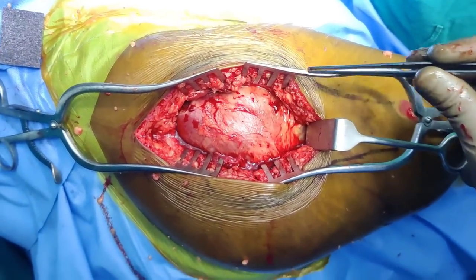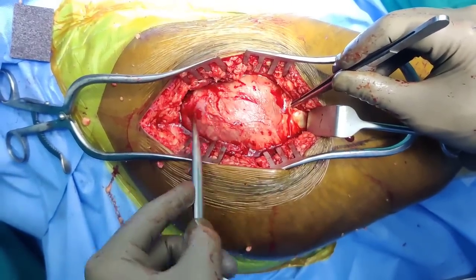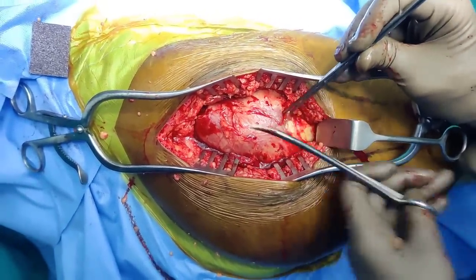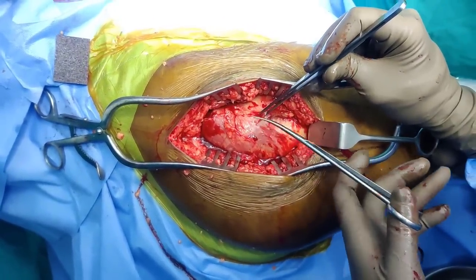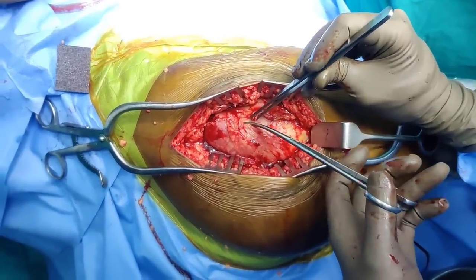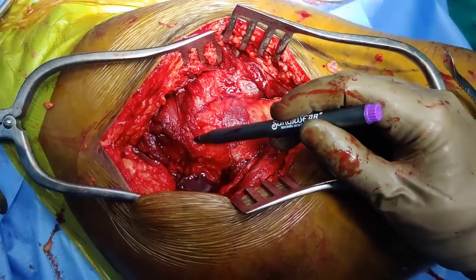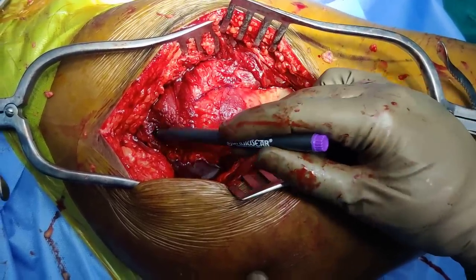We have repositioned our self-retaining retractor in the front and in the back. This is the vastus lateralis, this is all the gluteus medius, and overlying on the top is the bursa. I am just taking this bursa off and dissecting it to expose the gluteus — this patient has got a really thick bursa. Just to orient you: this is your vastus lateralis, this is your greater trochanter, and all of this is your hip abductors, that is the gluteus medius.